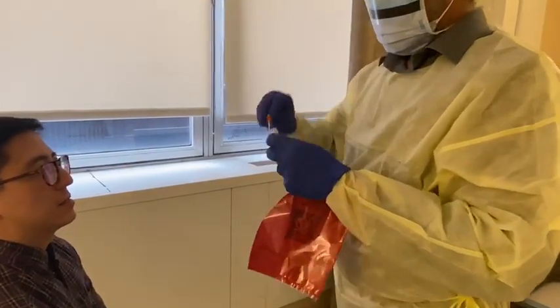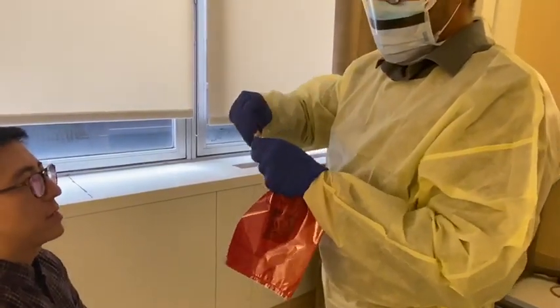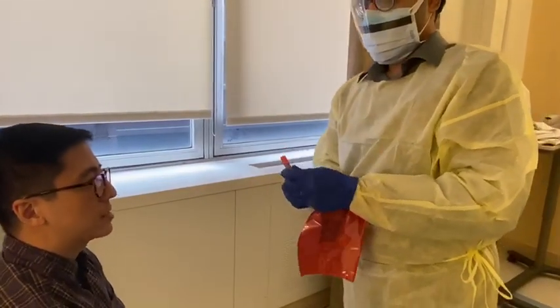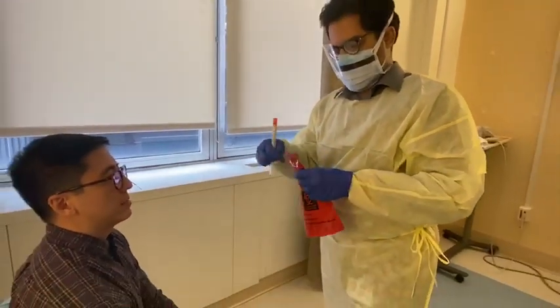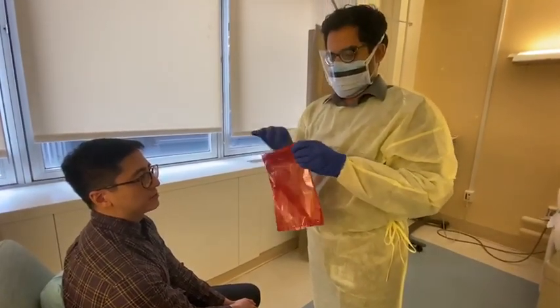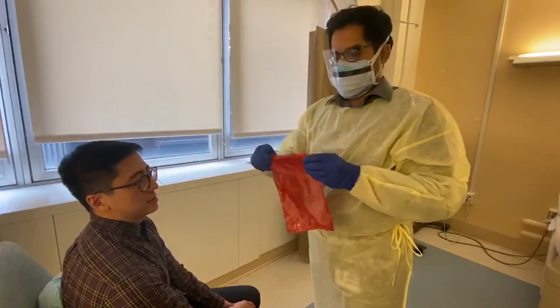The real kits have a little thing that screws right back on. He's going to put the cap back on the tube, and then put it in the biohazard bag and seal it off.